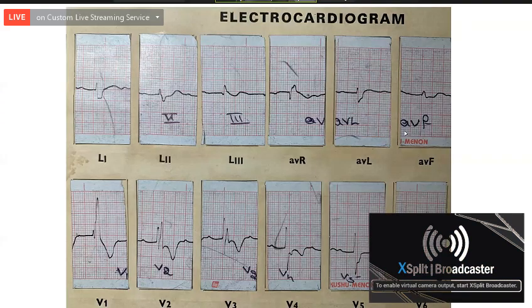Okay, this is simpler. Any volunteers? Look at the electrocardiogram well. Then once you have got some idea, you can start talking. Sinus rhythm, sinus rhythm, very good.